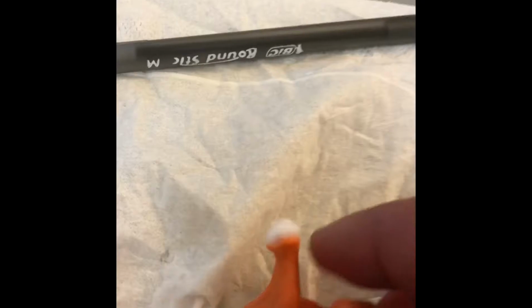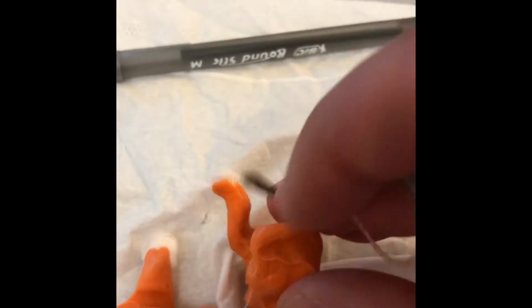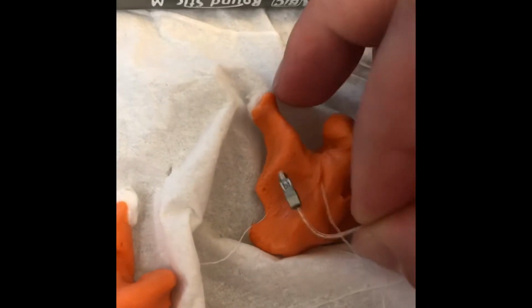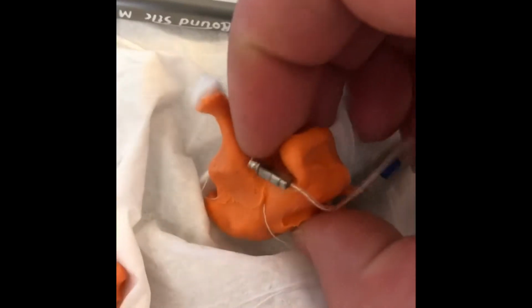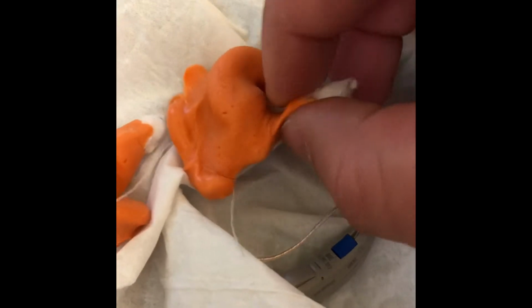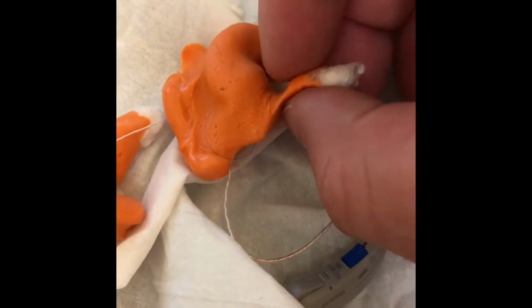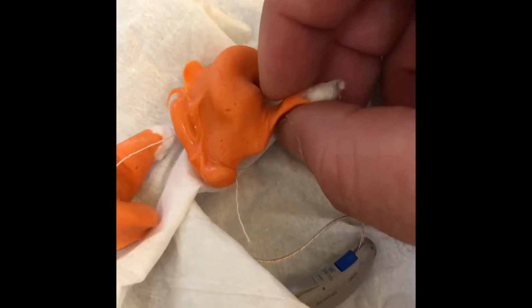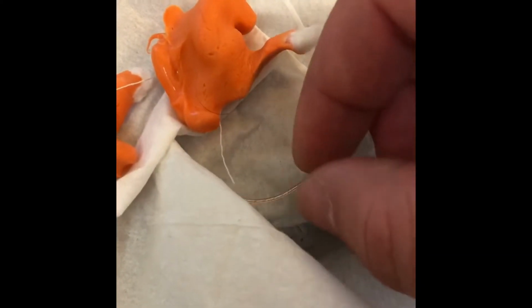Very, very small. To give you an idea of reference, that little speaker as it goes in there, if they build a mold around it, they're going to have to build up the aperture around where my finger is, that skinny part, in order for it to fit, and then it's going to be uncomfortable. Even without anything in, her ear canal is collapsed and so small, paper thin, that with the RIC receiver in her ear, it was actually occluding her ear. Now we need to put on a mold to secure the hearing aids on her ears, because of how active she is.